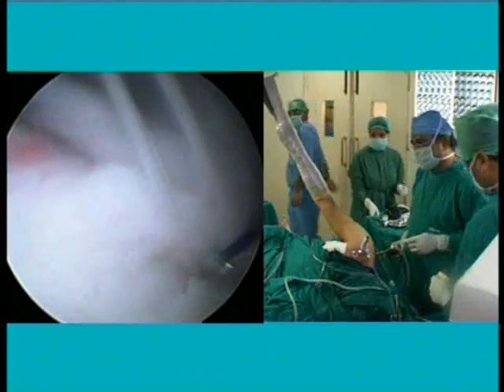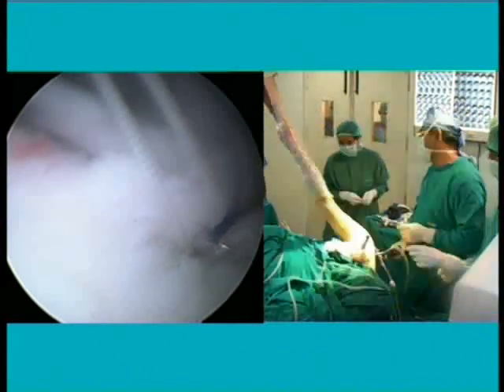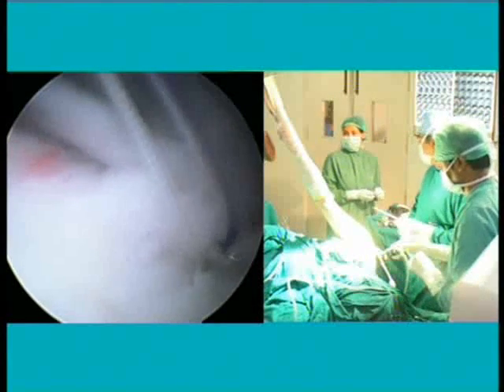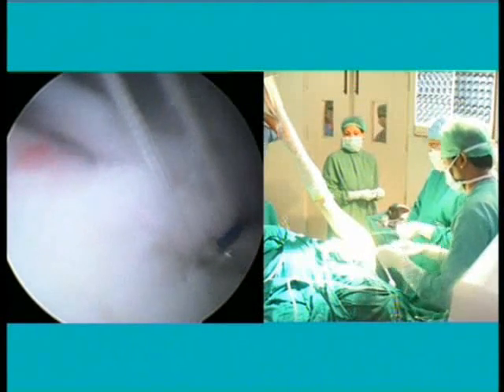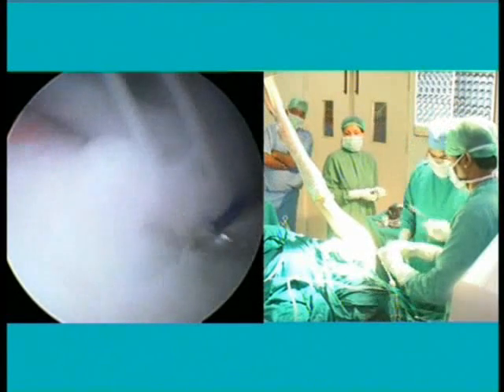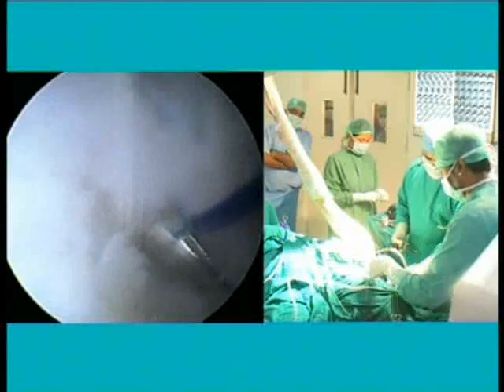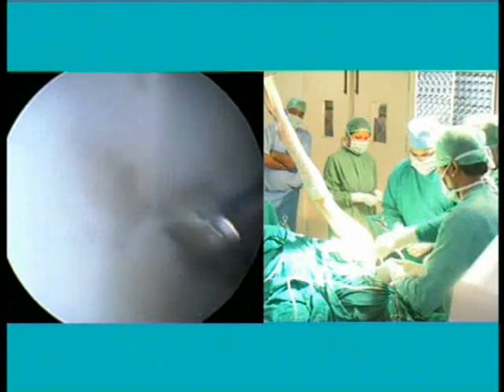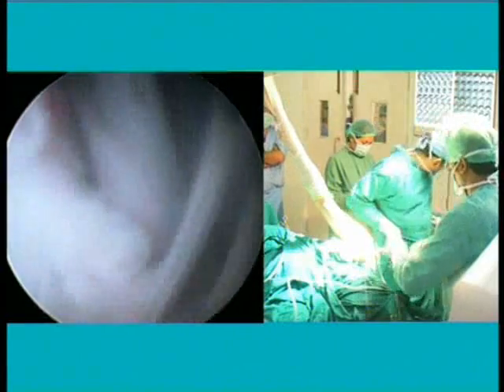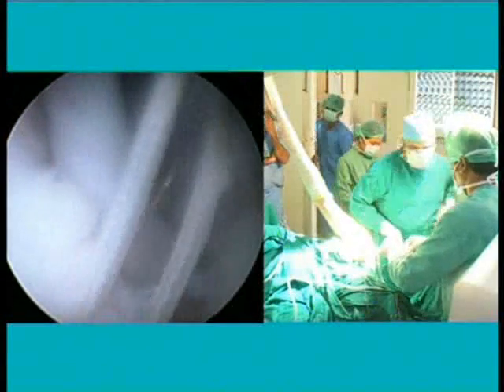The principle is that the ligaments, the coracoclavicular ligaments, heal around it, and the implant provides stability.